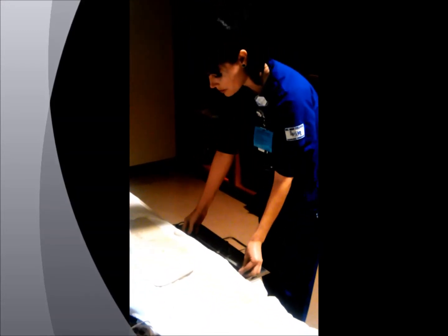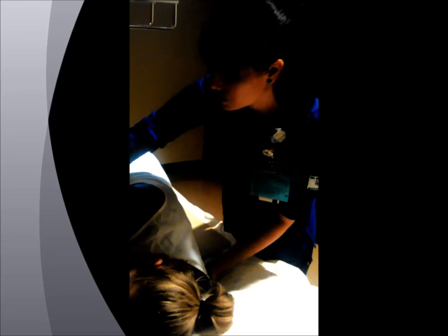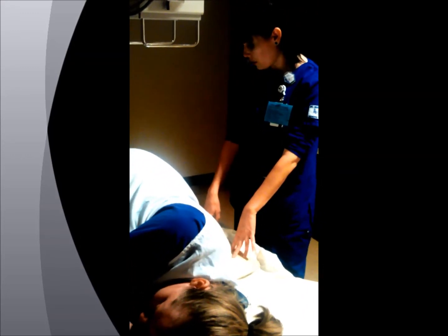We're going to have our IR in here and make sure that it's lined up and ready to go. Your patient should already be in the lateral position from their lateral lumbar, so we're just going to make sure that she is still in true lateral. So ma'am, I'm just going to move you. We want to make sure that the hips and the shoulders are aligned. Okay, we're going to still have our lead mat behind our patient to help with scatter.